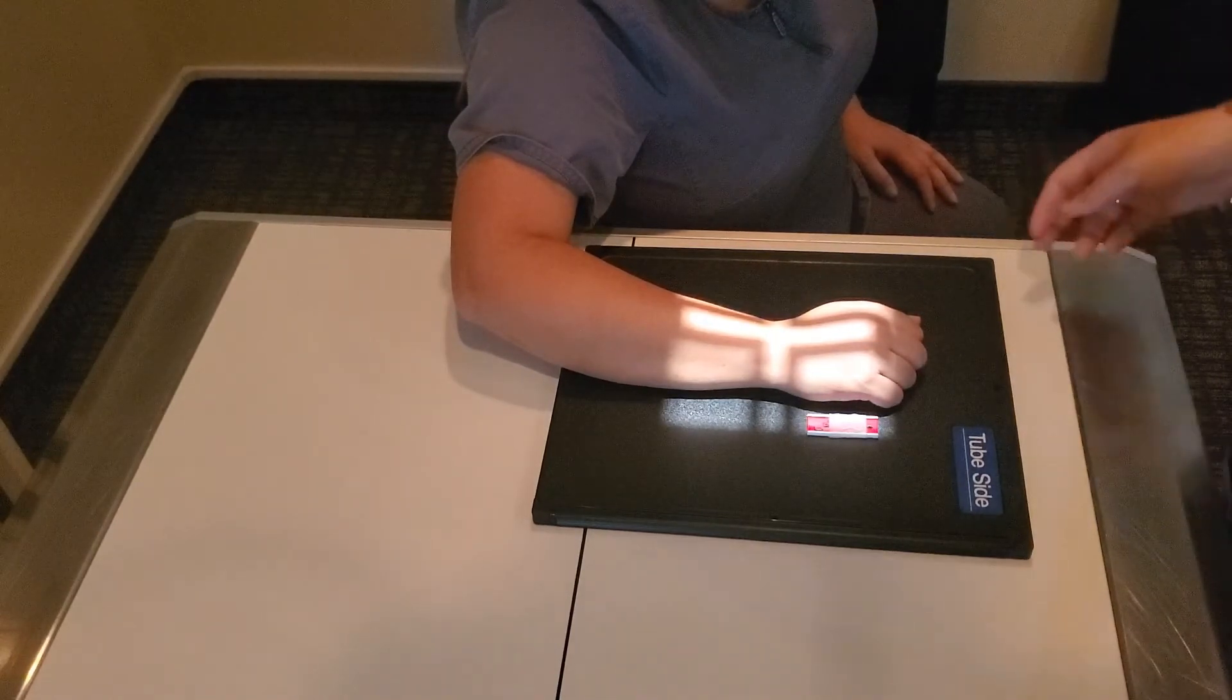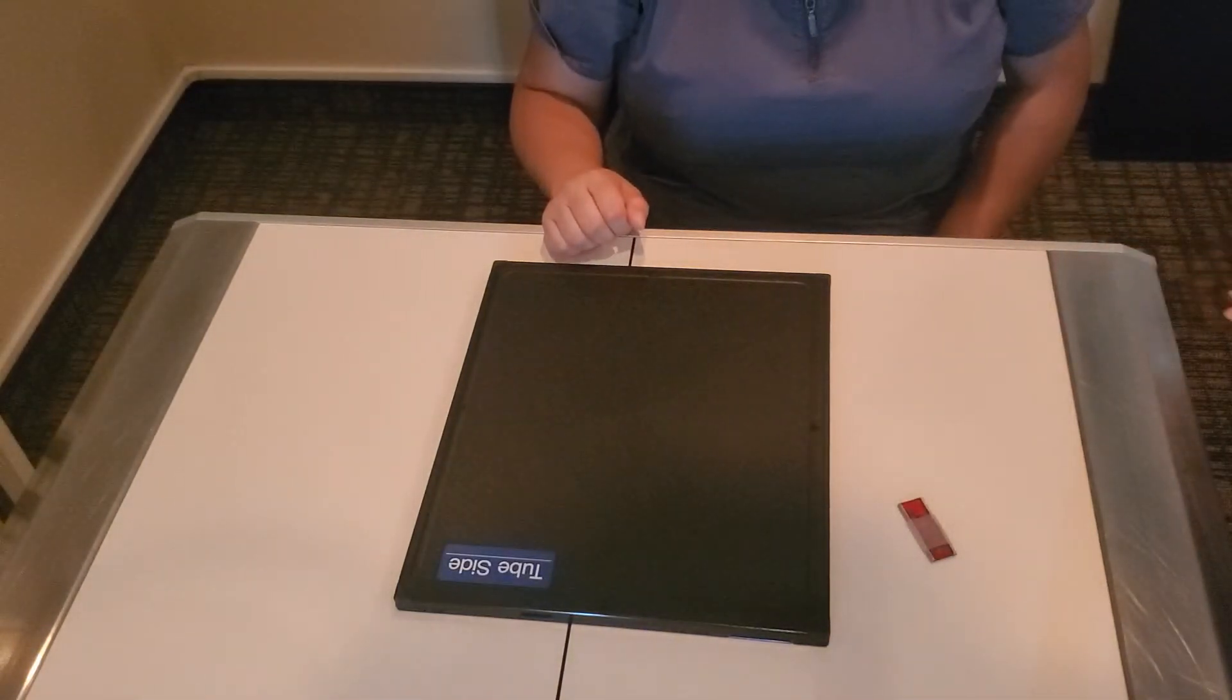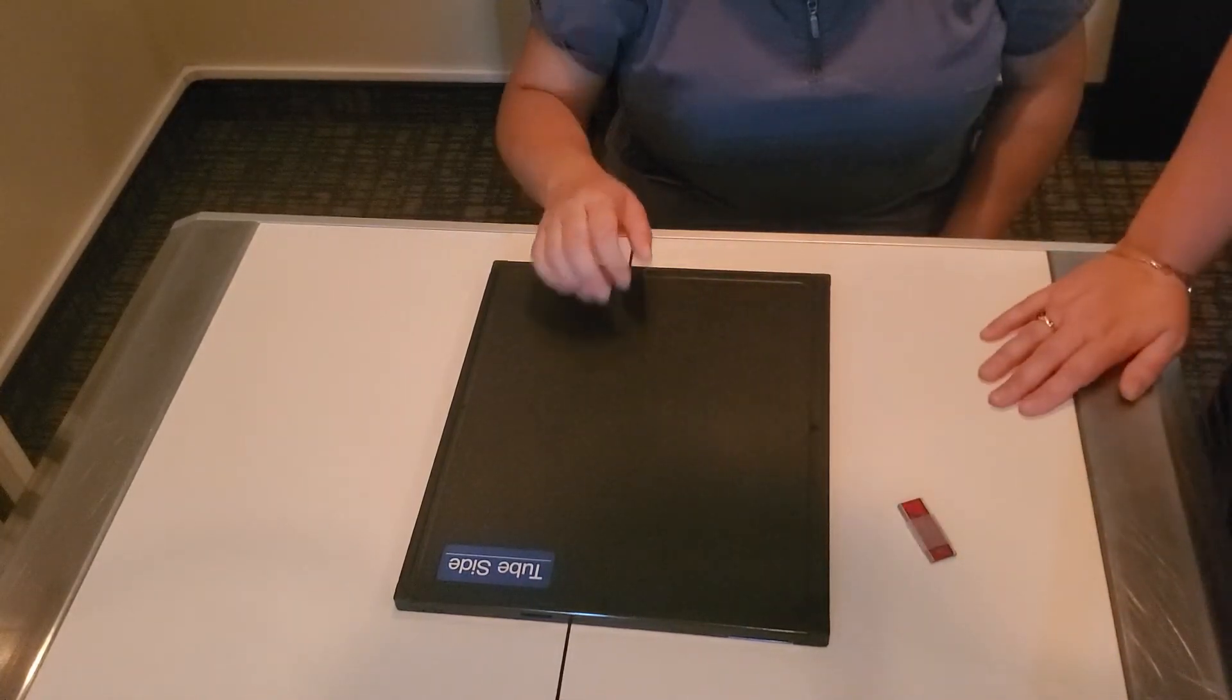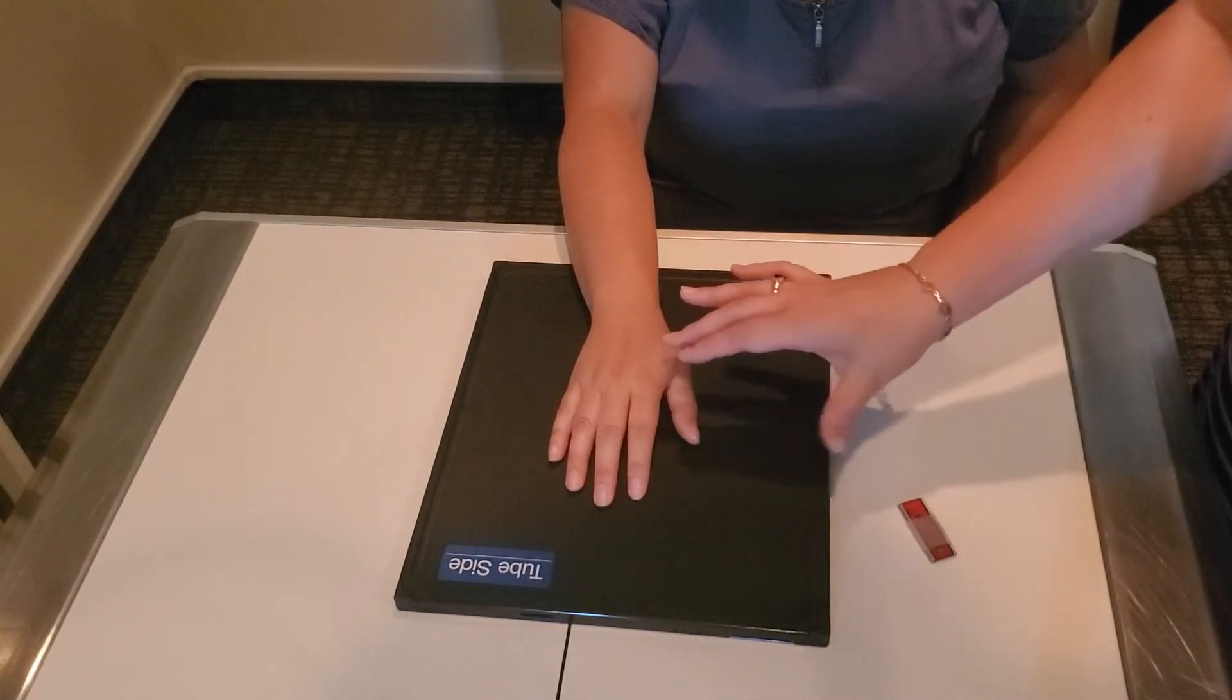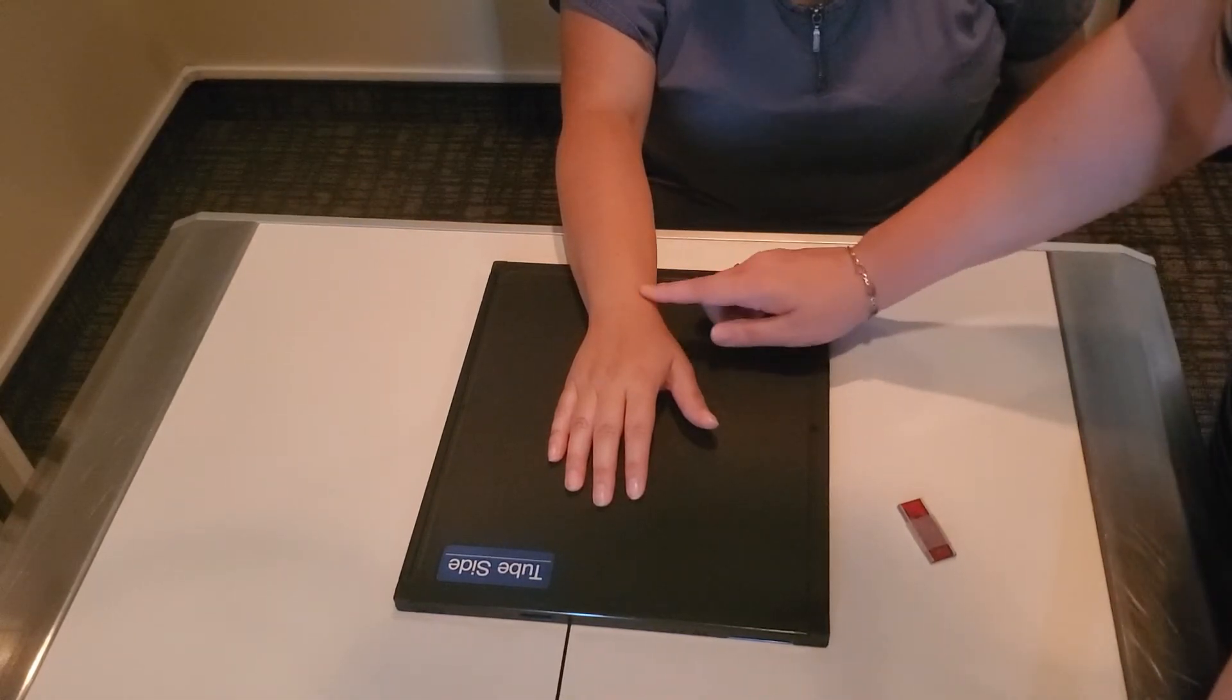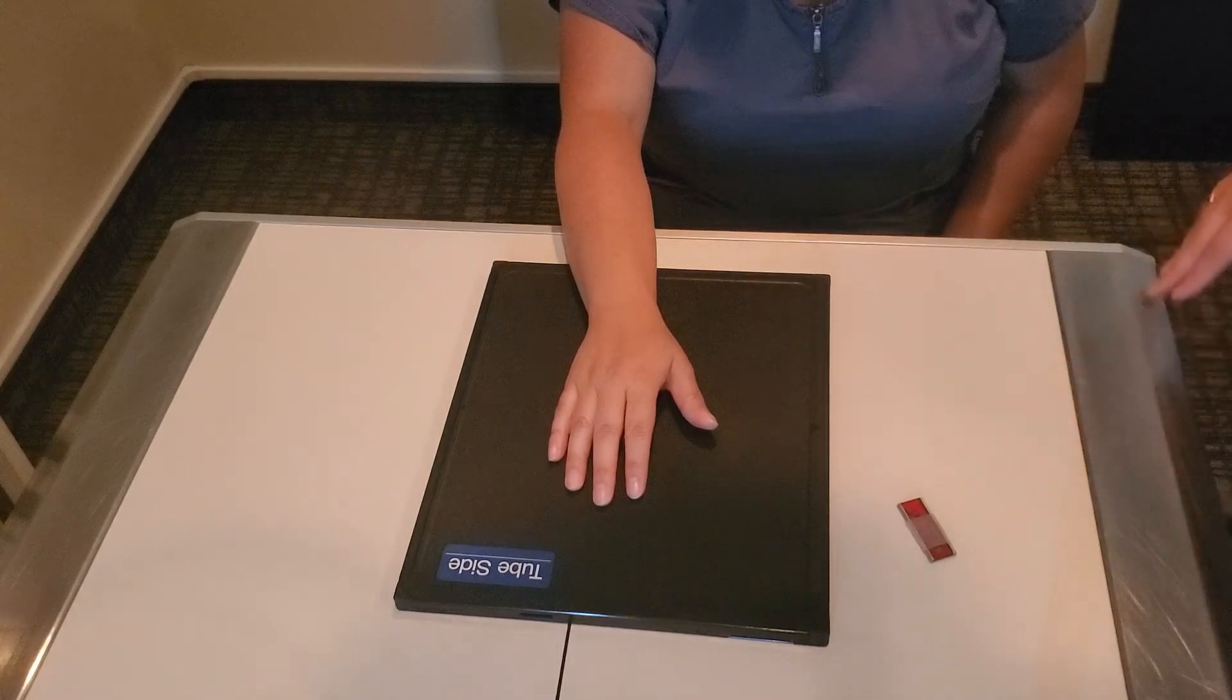So I'm going to let you face forward again for me and I'm going to turn this back to lengthwise and so our first one we're going to do is just simple ulnar deviation and again remember it's rad to be an x-ray tech so ulnar deviations on the fifth digit side. I'm going to have you rest your hand down. And this image again is looking specifically for the scaphoid. If you flex your hand a little bit or the patient's thumb the snuff box is kind of where you're centering to that's right down. Basically if you go directly below the metacarpal of the first digit it's approximately where you're going to want to center that's where that scaphoid lives, okay?